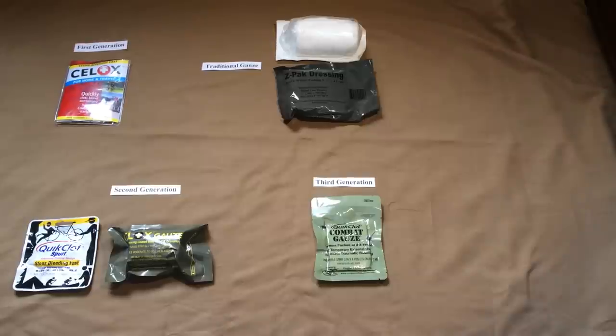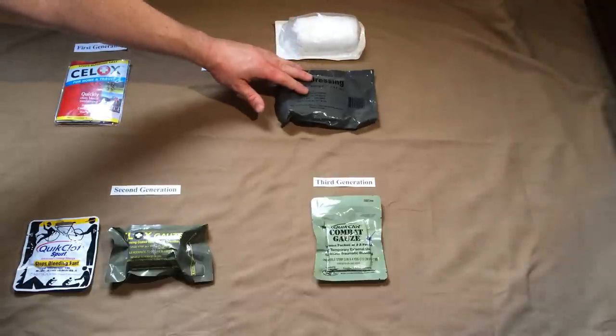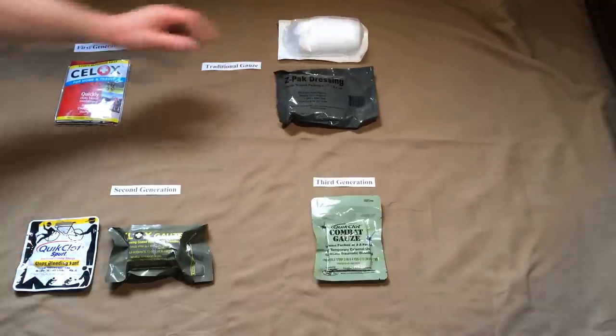Let me start by talking about the standard dressing that has been in use for some time — the Curalex gauze dressing. Today you'll find Curalex used both in the hospital and in the field. It's easy to pack into a wound, very absorptive — it absorbs blood and other fluids readily — and you can compress it well. It does not have friable, thread-like components like a lot of gauze can have, so you don't have to worry about leaving behind small thread particles in the wound. It has a lot of advantages over other wound packing materials.